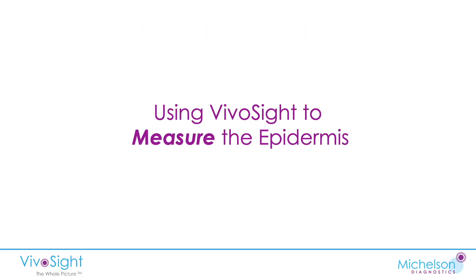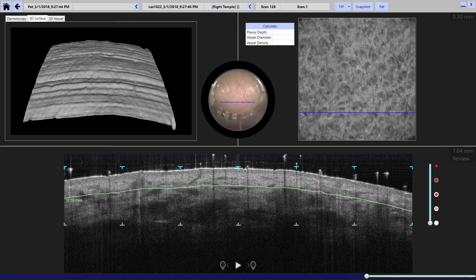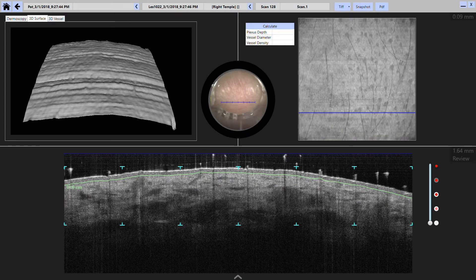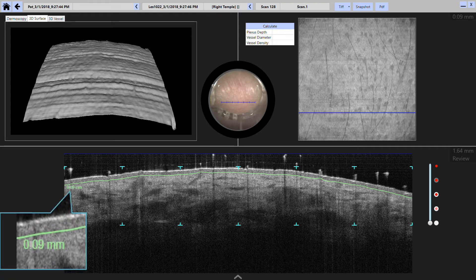So how do we use VivaCite to actually measure the epidermis? It's fairly easy to eyeball where the epidermis is. This is a screenshot of what you see on the VivaCite after capturing an image of some normal skin, and you can see the epidermis layer. It's easy to click and drag the green line up to the boundary and then read off the thickness of the epidermis — in this case, 0.09 millimeters, which is 90 microns.